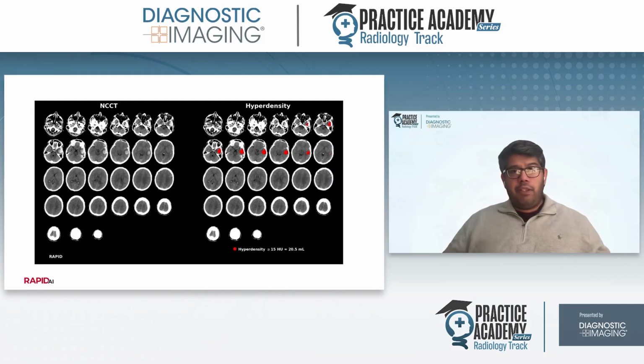And Rapid just simplifies the process. Even if I was to calculate this volume myself, I would be giving an approximation, but Rapid gives you a very specific measurement, which is far more accurate. A lot of these hematomas end up being irregularly shaped. To do a 3-line measurement and then give a volume tends to be a more archaic way of doing things. Whereas what Rapid is doing here, giving you the volume by identifying the actual voxels, is a much better and more accurate calculation. And they have shown that in studies as well.